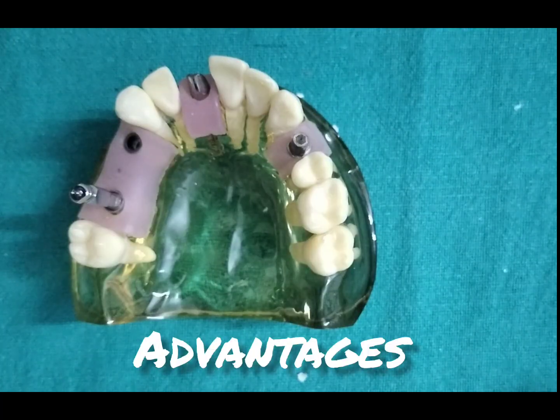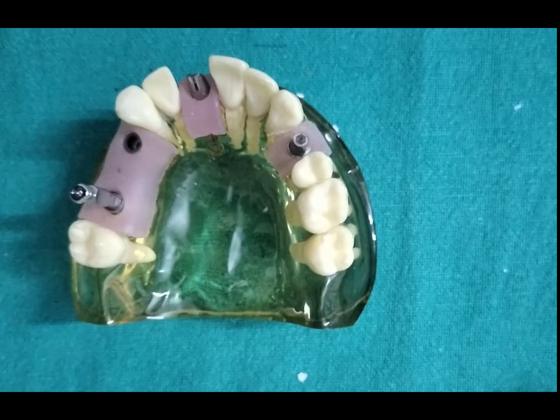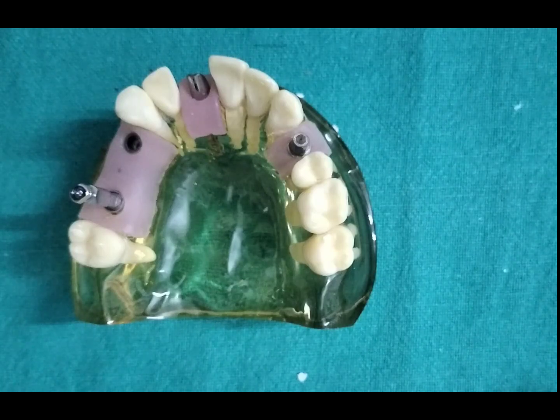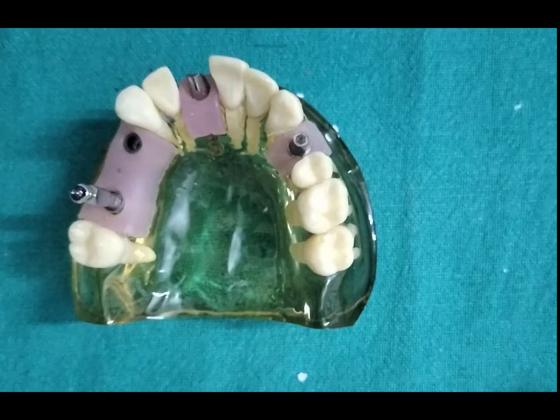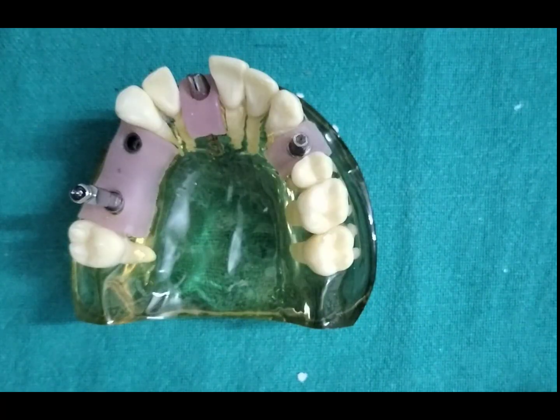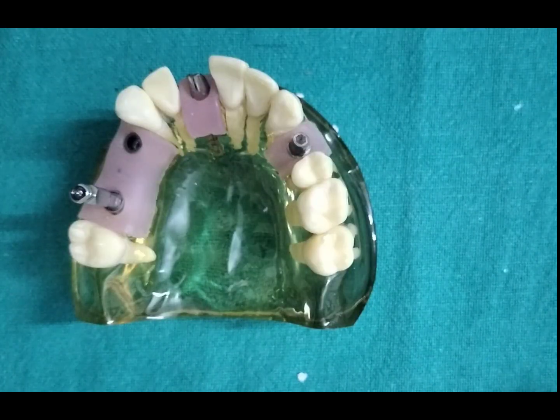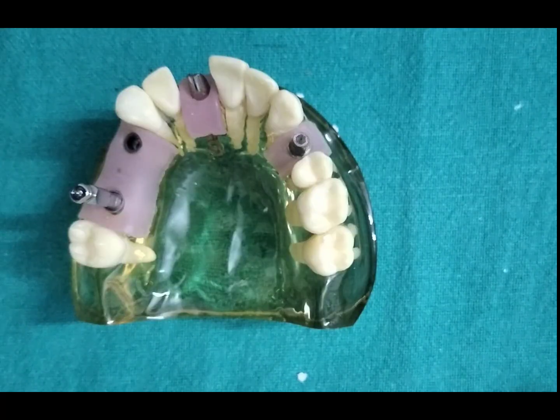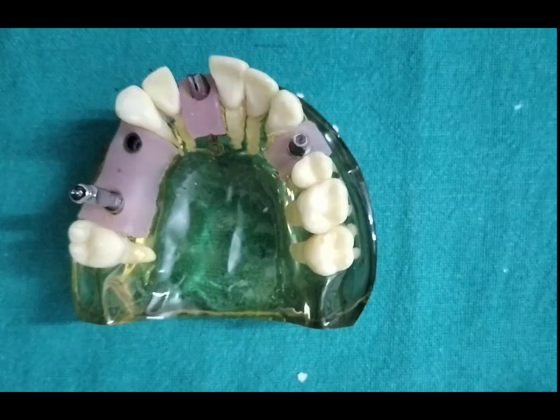Advantage of the open impression technique is that it is more accurate because we are directly removing it. We don't have to reposition any impression coping into the impression. So it is preferred for multiple implants. As I told you, it has reduced repositioning errors as we don't have to reposition anything. Drawback is it is more technique sensitive. Any error while making the impression, the chances of failure are there. It requires tray modification. You have to modify the tray, and slightly more chairside time is required in this technique.